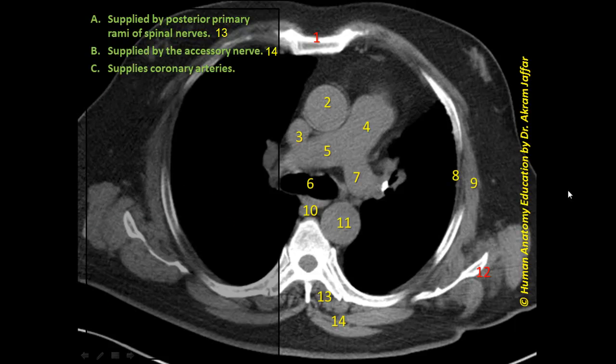The next phrase: 'supplies coronary arteries.' The artery that supplies the coronary arteries is the ascending aorta. The ascending aorta supplies the right and left coronary arteries, so this matches with structure 2.